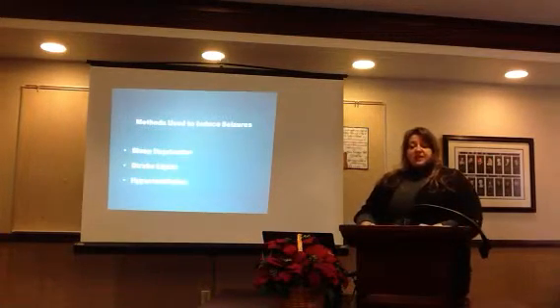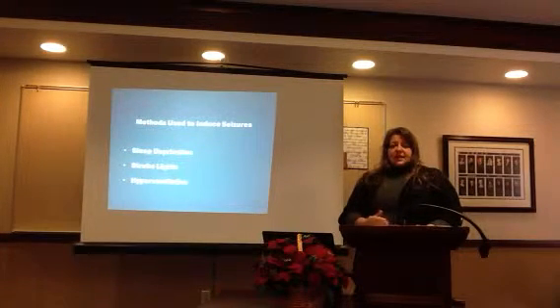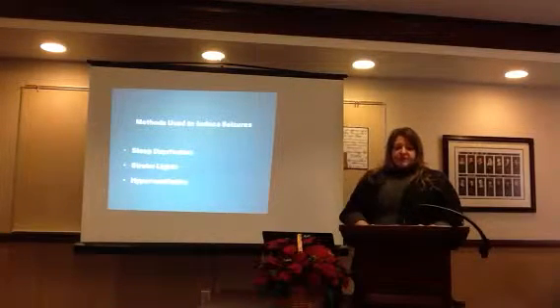When the EEG is finished, the patient is allowed to leave. They're disconnected and allowed to leave and then return at a later date to review the results of the test with the doctor.